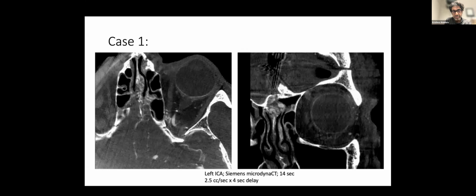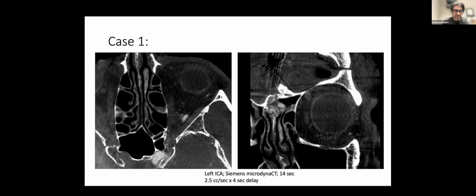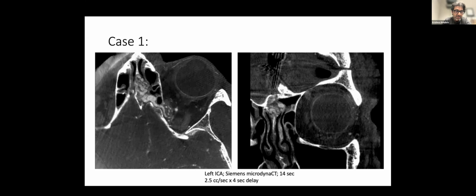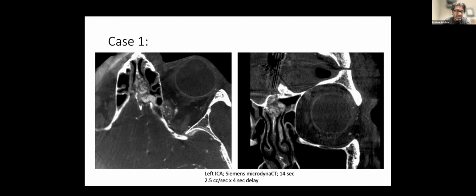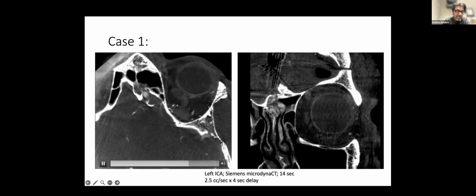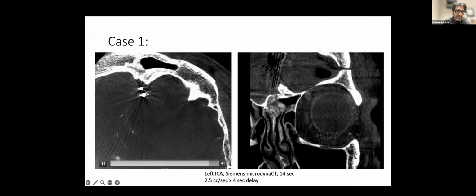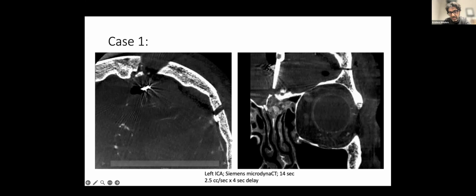So we're able to do a Dyna CT scan. And as you'll see on the next case, these Dyna CTs are very, very helpful in elucidating the anatomy. So you can see that the ophthalmic artery is still dilated. You can see these arterial feeders extending through the medial orbital wall into this variceal enlargement within the ethmoidal air cells. And as you come up, you can actually see there's residual varix here, inferior to the level of the two clips. And here it is on coronal.